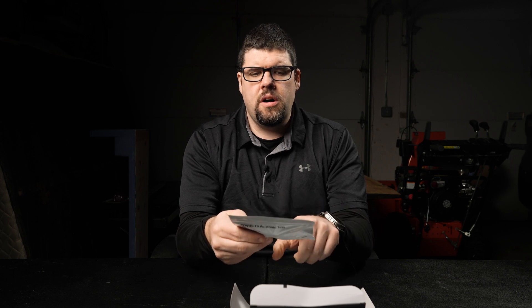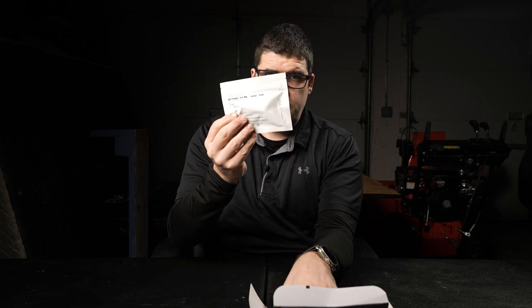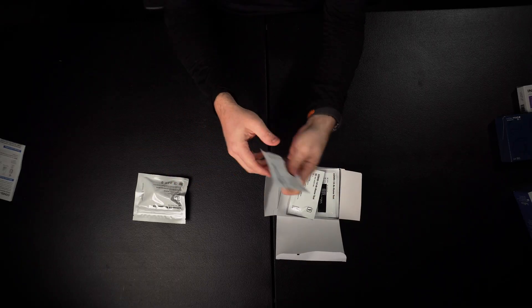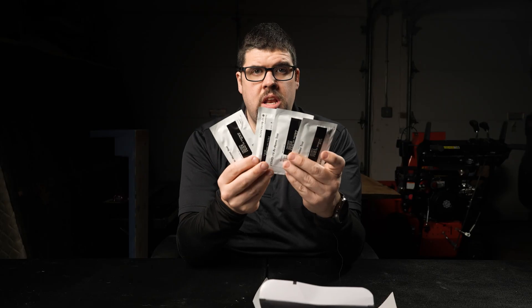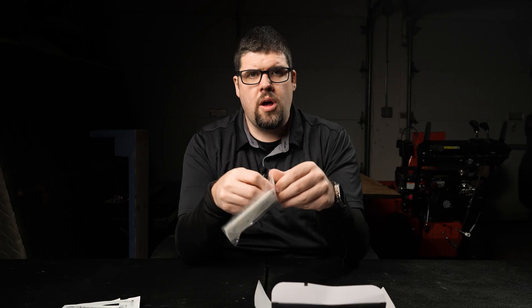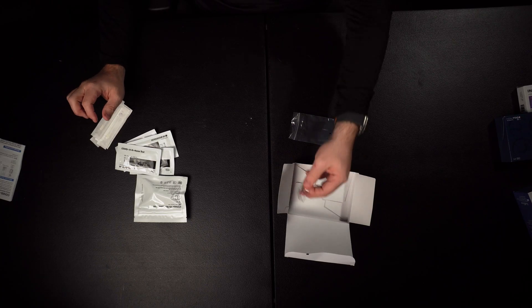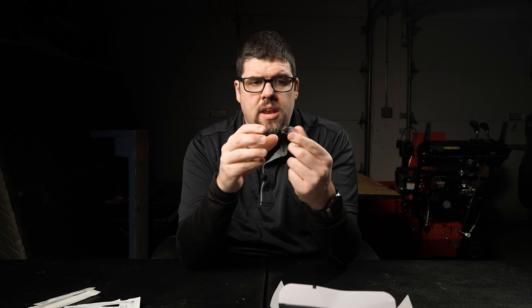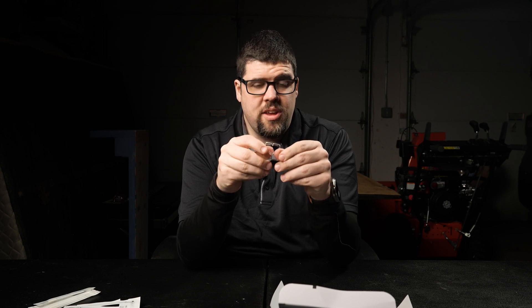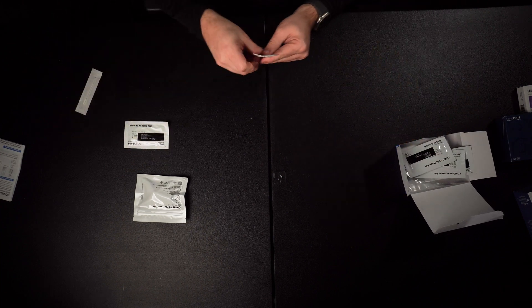Right here we have the COVID-19 vials of liquid that you're going to have to use for your test kit. There are four of them in this package — it's a ziplock package, so once you're done make sure you zip it back up. Right here we have four individual test strips. Here we have the cotton swabs that you're going to put up your nose. And last but not least, there's this little template which comes in pretty handy.